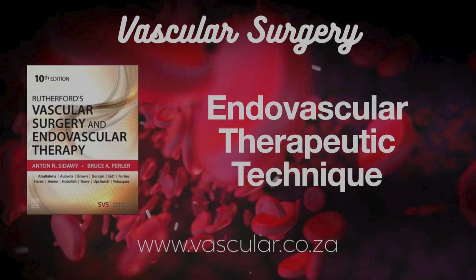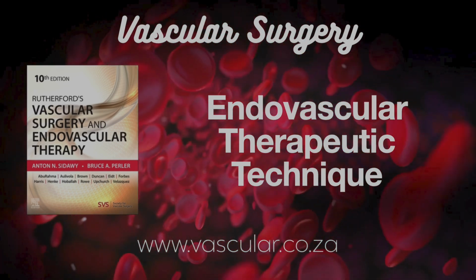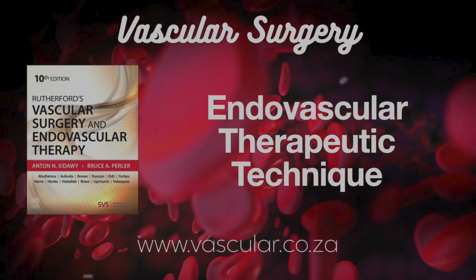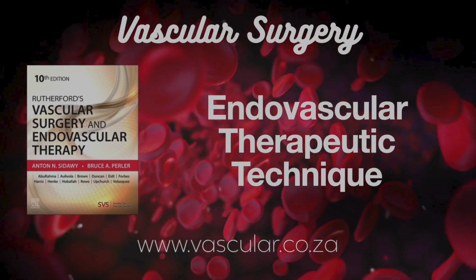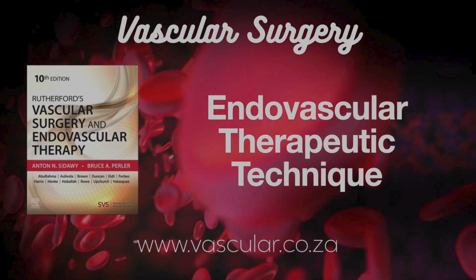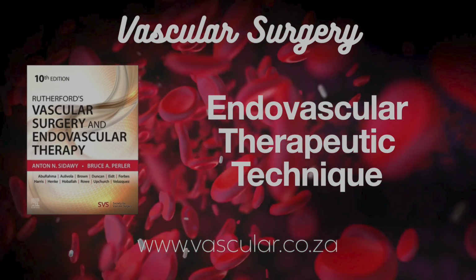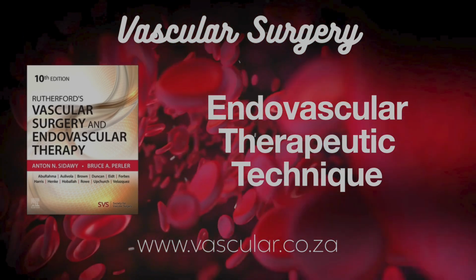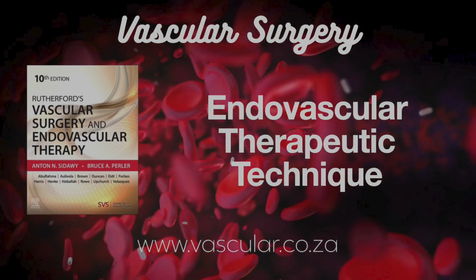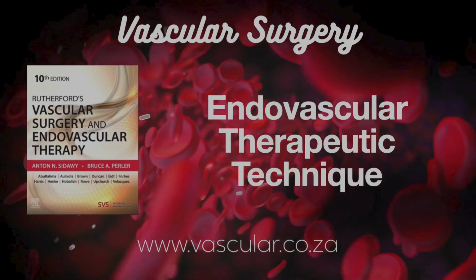Makes sense. Okay, let's circle back to drug-coated balloons. We touched on them as a stent alternative. Let's get into the details, how they work, the evidence. Right. So as we said, DCBs deliver anti-proliferative drugs right to the vessel wall during that brief inflation, aiming to stop smooth muscle cell growth, the main culprit in restenosis. Inspired by drug-eluting stents in the heart. Exactly. Those coronary DES, like Cypher with sirolimus or Taxus with paclitaxel, were a big deal for reducing re-narrowing in heart arteries. DCBs try to get that drug effect without the permanent implant.